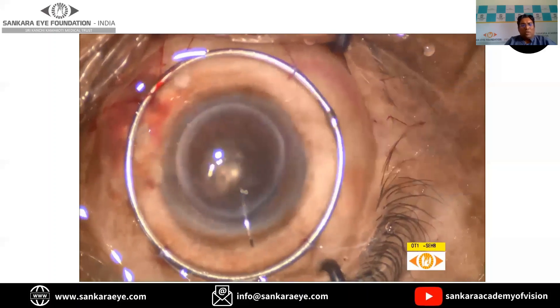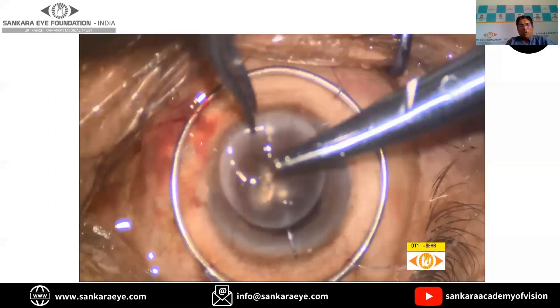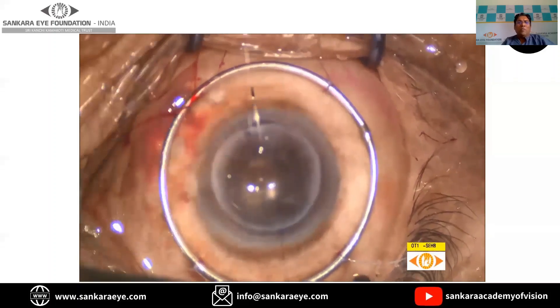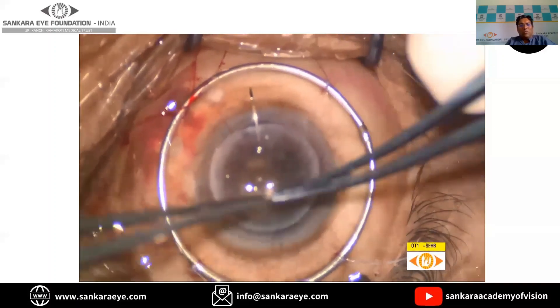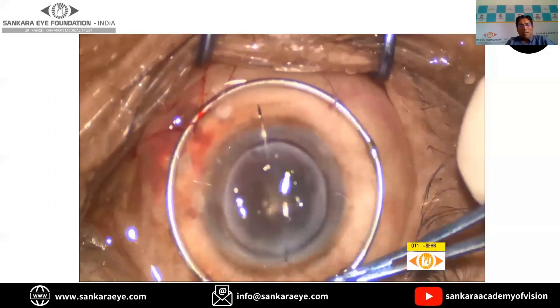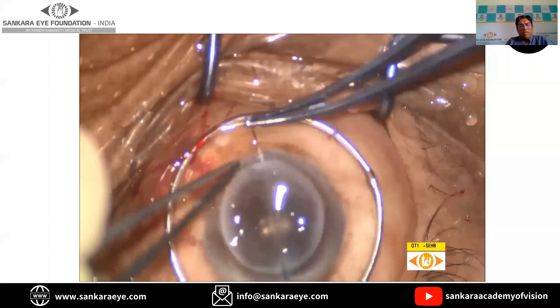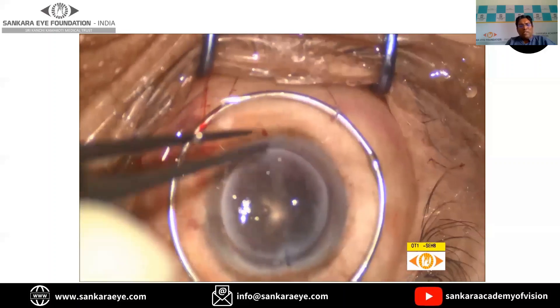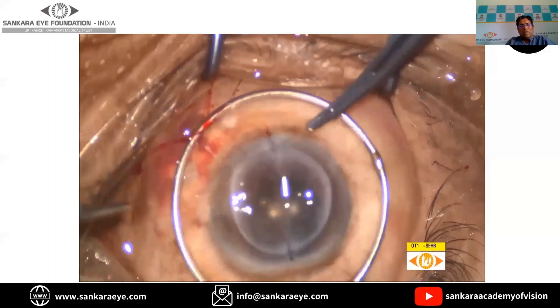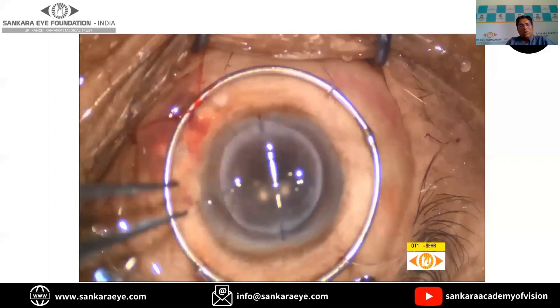The first four sutures are known as the cardinal sutures and are by far the most important sutures. Always the 12 o'clock suture is placed first, followed by the 6 o'clock suture. Among all the sutures, the 6 o'clock suture is the most important because it will determine how the astigmatism is going to be. Once the sutures are placed, mainly at 90% depth, one millimeter on either side, and the suture ends are cut closely to the knot. Then the 3 o'clock and 9 o'clock sutures are placed.